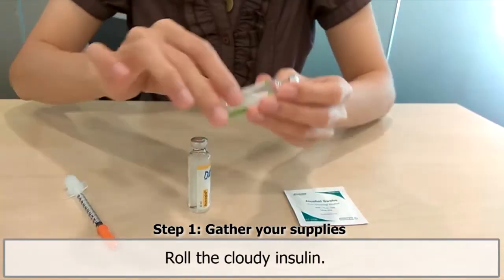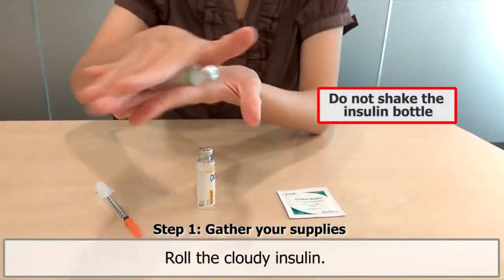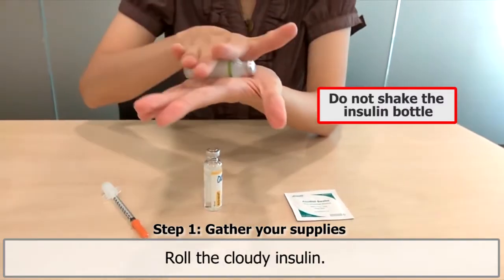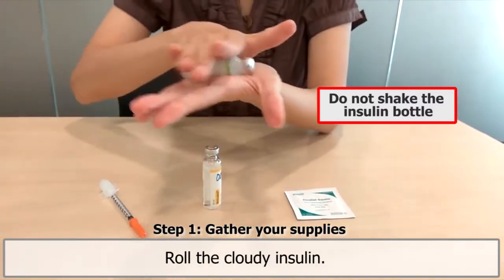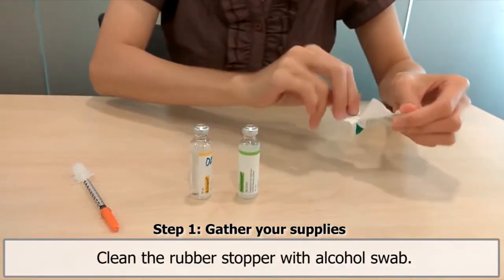Roll the cloudy insulin bottle between your palms at least 10 times to allow the suspension to mix well. Do not shake the insulin bottle. Clean the rubber stopper with an alcohol swab.